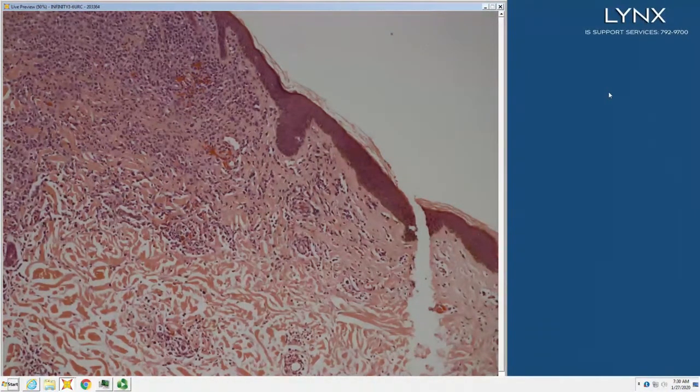You've got papillodermal fibrosis, and intercalated between those horizontally oriented, dense, hyalinized collagen fibers are T cells, and often they line up in rows and they sit in little vacuoles like lumps of coal on a pillow.